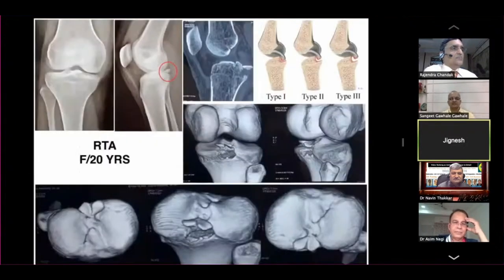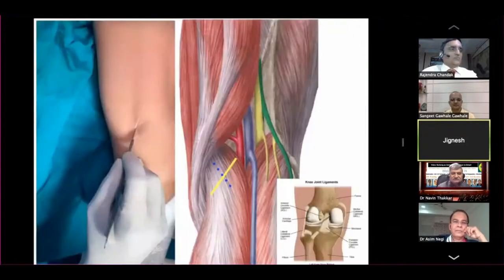This is a Type 3 avulsion of the PCL — totally avulsed from the crater base. This is the CT scan showing the fragment size. And that is the approach: the yellow line is the skin incision and the blue dotted line is a split inside the gastrocnemius muscle medial head. We split in two parts and the medial half will protect the vessels.